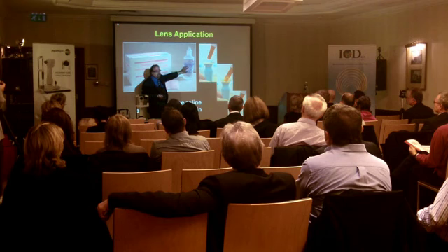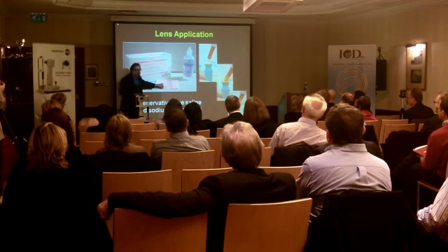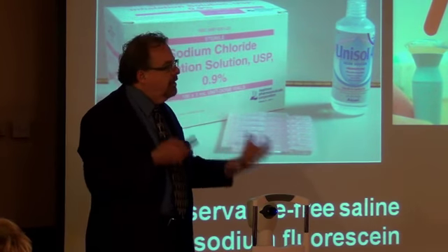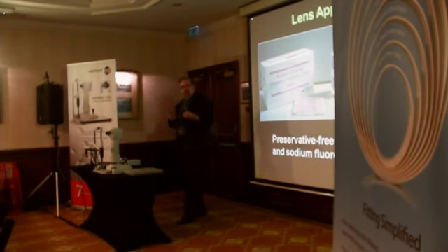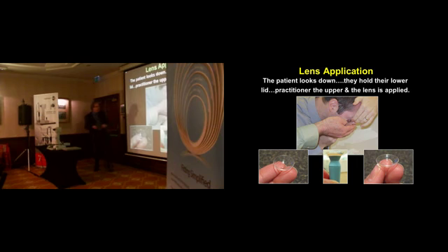Many times they'll apply the lens with a pH balanced saline and say, it's just not comfortable. We'll put them in the pH of 5 and they say, oh my gosh, that's 100% better. So individual patients, especially with the pathologic eye, may find certain solutions a bit more comfortable for them.